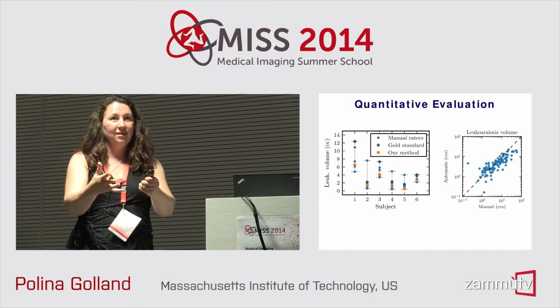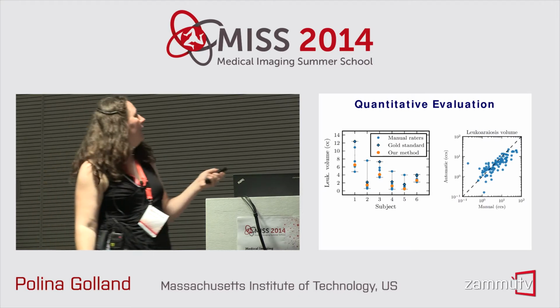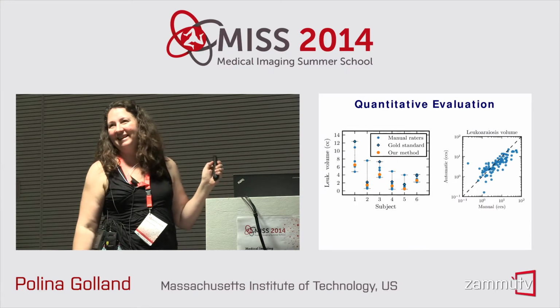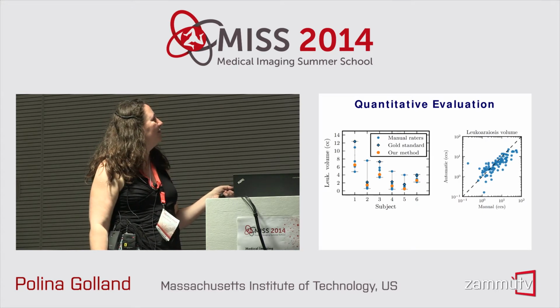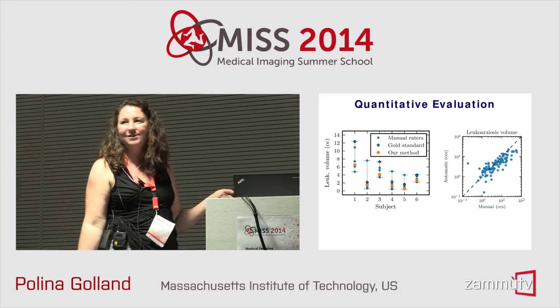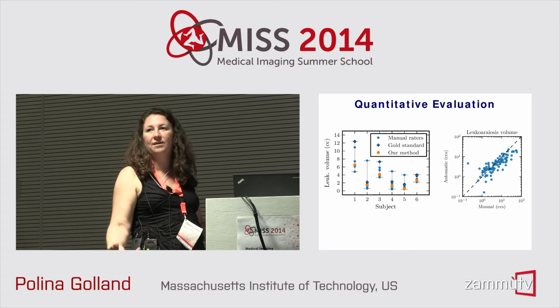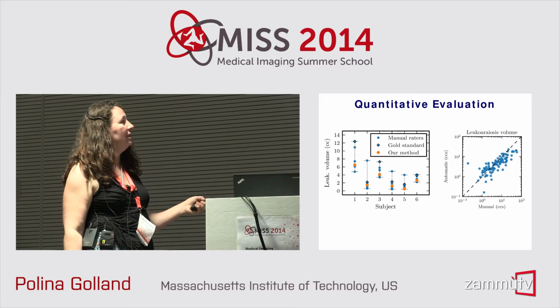So we'll segment the leukoaraiosis, but then look at the volume of leukoaraiosis as a marker of how well we're doing. The gold standard is the super expert segmentor who declared themselves the gold standard. In some sense, there is very little difference between the blue circles and the blue diamond, as all of them are just humans doing the segmentations. But the orange dots are our algorithm, and you can see that in all the cases we're within what the humans disagree on.